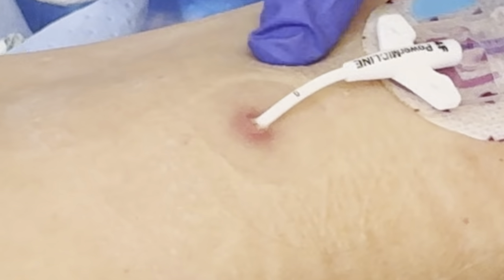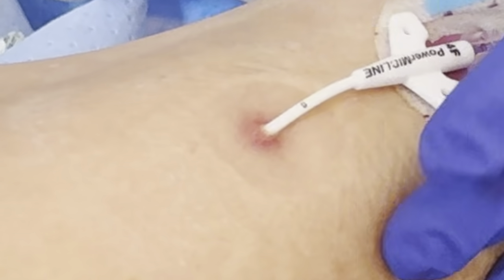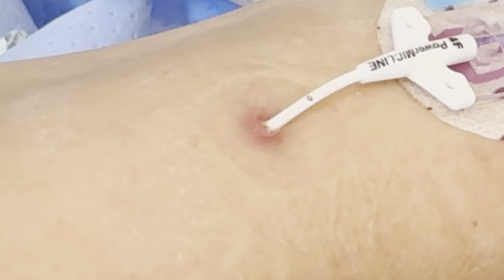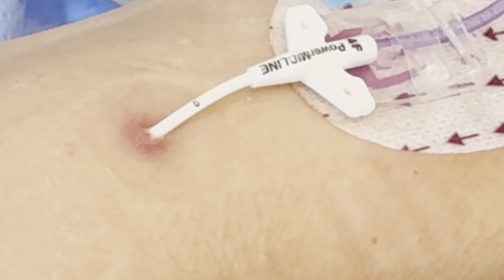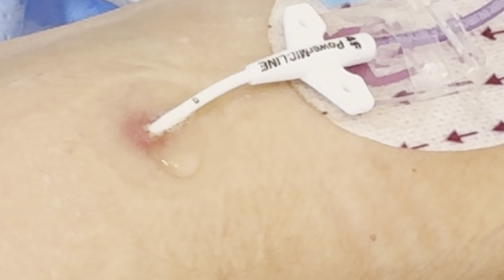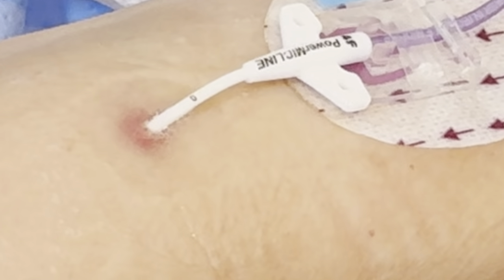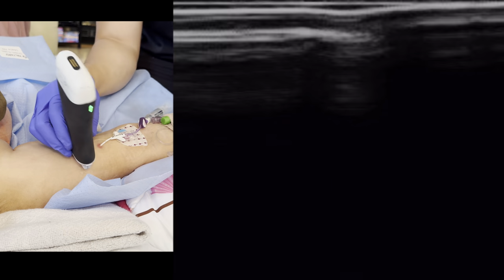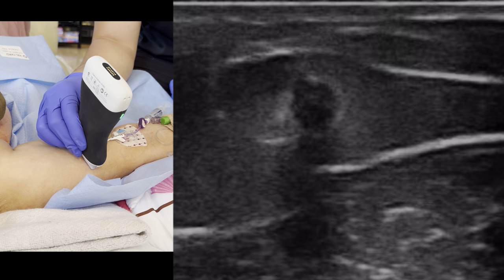Now we're going to wash it — it's already leaking. You can see the fluid coming out. I saw it last night. Was it painful when I flushed? No. I'm going to flush a little bit more. You guys see that? Yeah, it's leaking. That's pretty much a complete obstruction. We're going to take a look under ultrasound. Here is the patient's insertion site — you can see it's definitely too small. We're going to be as gentle with our pressure as possible so we're not compressing the vein.